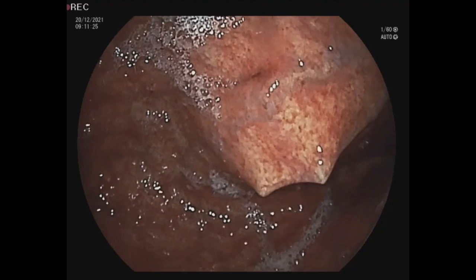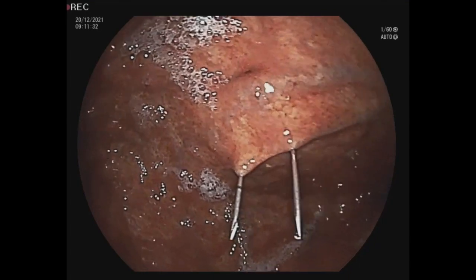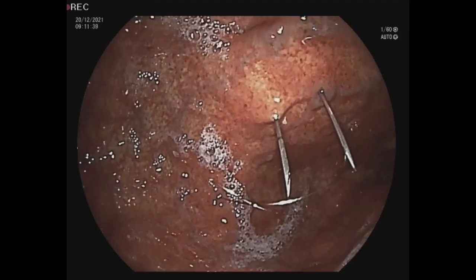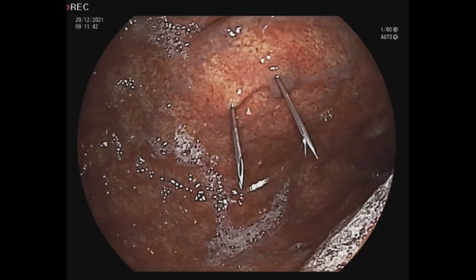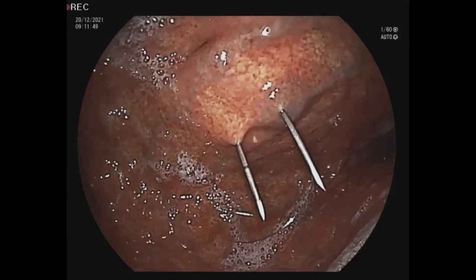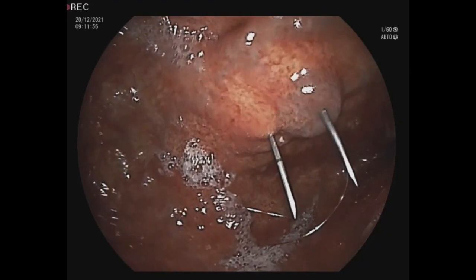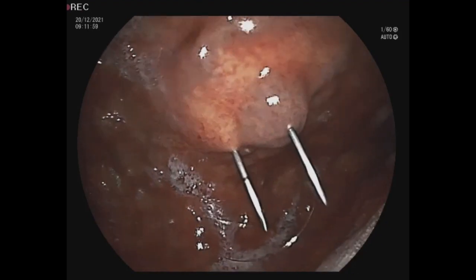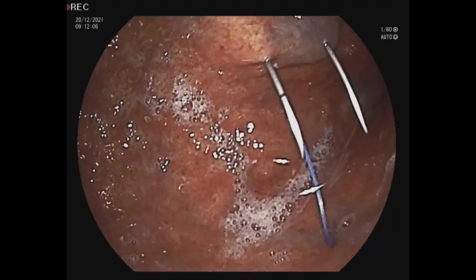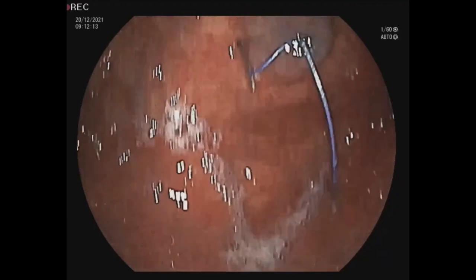Normally we do it two times, as you can see in this video. This is the second one. When we make two stitches, the gastropexy will be finished and we can make the hole for the balloon pack. Here you can see the second stitch — how we catch it with the metallic part.